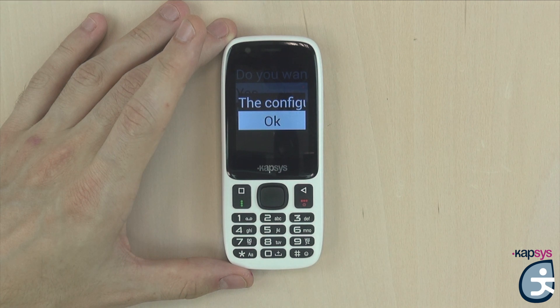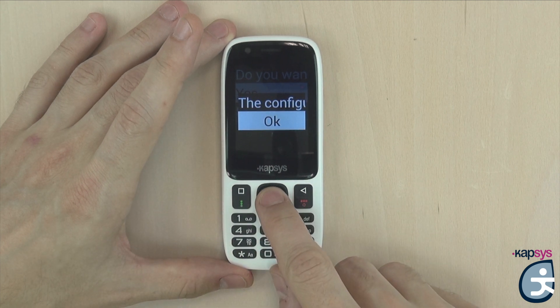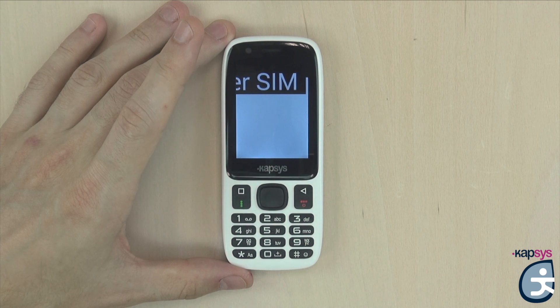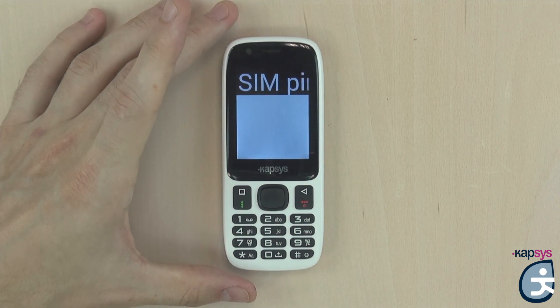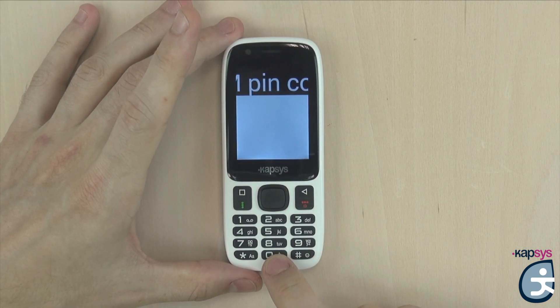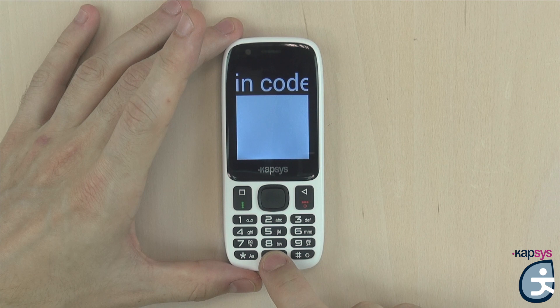For any questions, please consult the user guide on our website www.capsys.com. Once setup is finished, press OK again to finalize. As we inserted a SIM card with a PIN, we will have to enter the security code with the alphanumeric keypad and confirm by pressing the OK key.